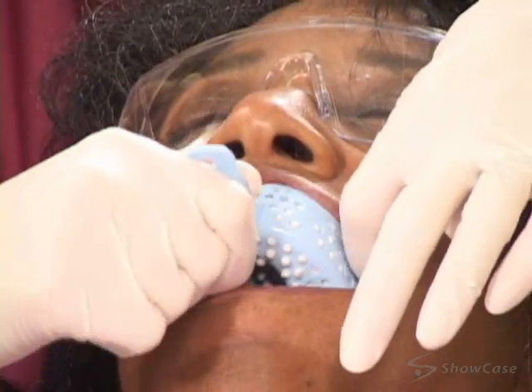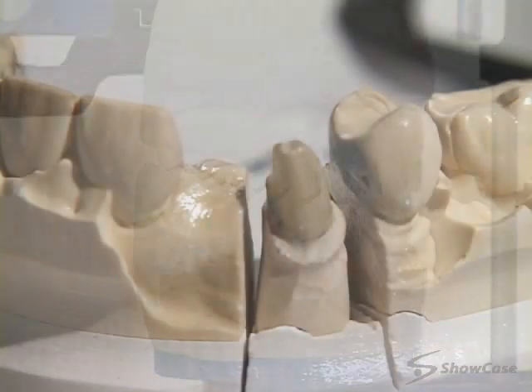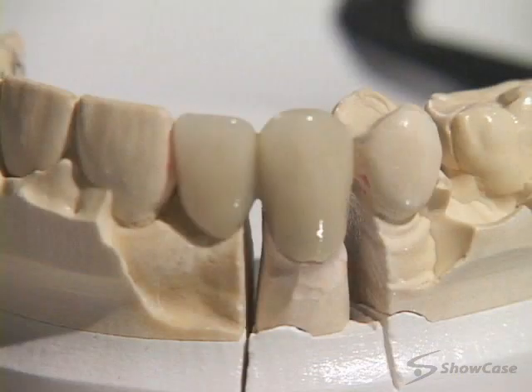Then we'll take an impression of your teeth. The lab uses the impression to make a model of your mouth, and they'll use the model to create a bridge that precisely fits your tooth and bite.